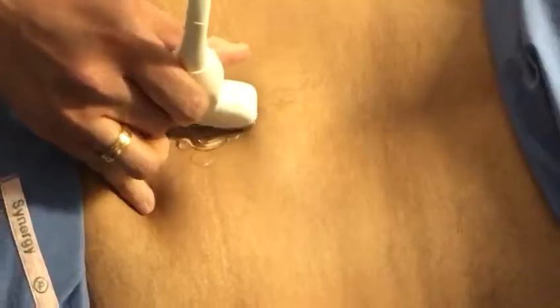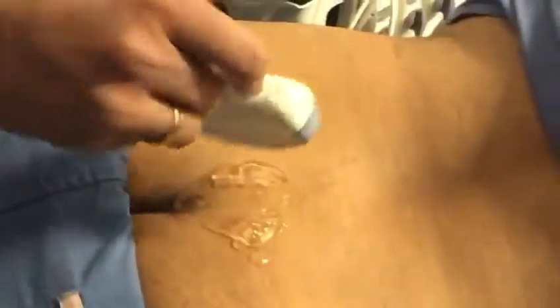Basically, spine is the area where you need to do plenty of ultrasound before you start to use ultrasound for the spine. The reason for that is you need to be very good at your needling skills. You need to be very good at finding the levels, counting the levels, and all that. Okay, so we start here, as you guys already know.